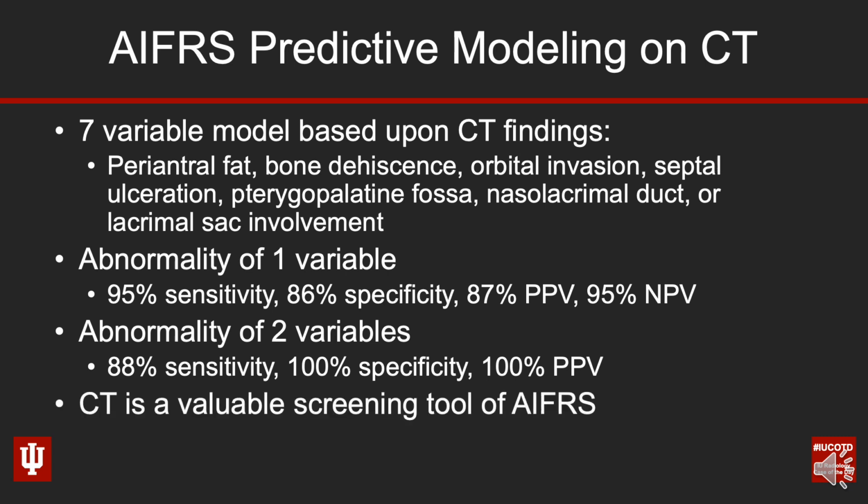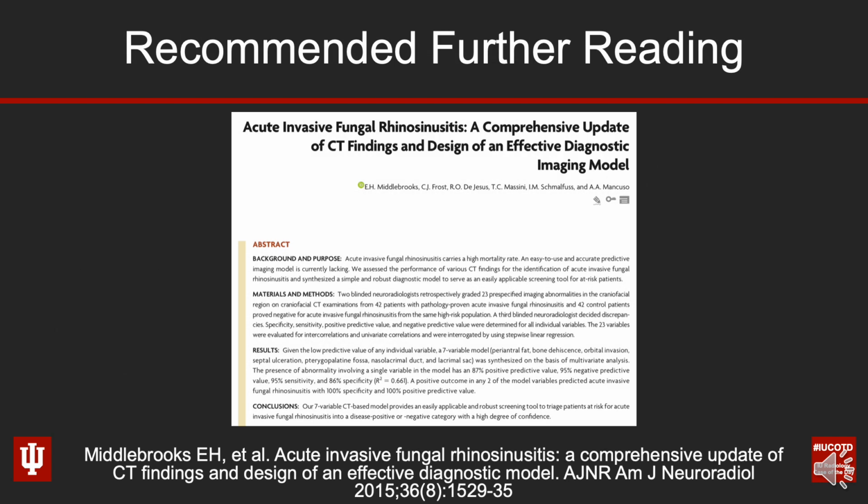So the take-home point here is that CT is a very, very valuable screening tool for making this diagnosis of acute invasive fungal rhinosinusitis. You just need to know what you're looking for and where to look for it. And here's the reference to that paper, again by the folks from the University of Florida, Ilana Schmalfus and Tony Mancuso's group. And it's absolutely worth checking out. If you're a resident, if you're a fellow, if you happen to read any neuroradiology studies, this is a paper to know about and know what to look for with these findings.